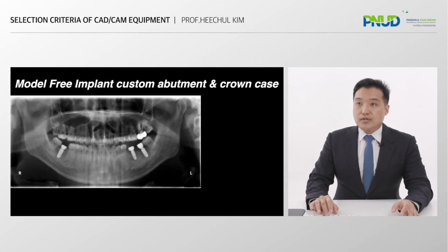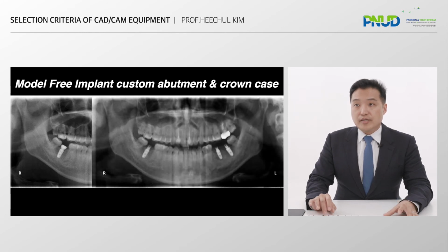Recently, we have seen changes through the advanced CNC milling process. This is a posterior missing case. The patient was scanned a week after the second surgery using scan post and Omnicam. We made sure that there was no bone or tissue engagement to the scan post through an X-ray examination, and confirmed that the scan body clicked into its correct position with a tactile sense.